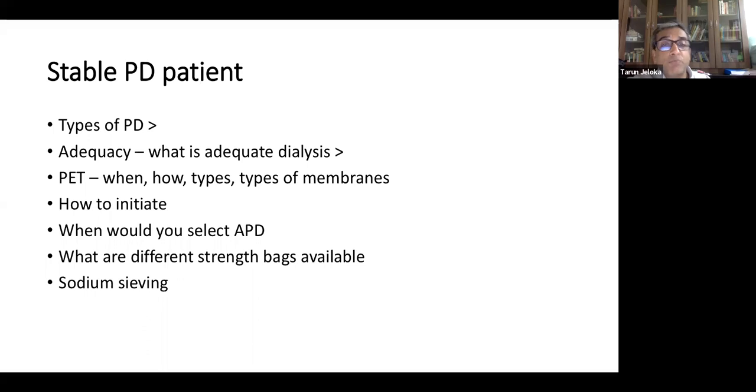But many times we do not initiate PD patients on a 24-hour cycle, to give some comfort and relaxation, and also for the concept of incremental dialysis, which you should know. When somebody is on CAPD, continuous ambulatory peritoneal dialysis, we give them a night dry. They do an exchange, 3 or 4, whatever you decide, during daytime only; nighttime is dry. So the belly is dry at night, and practically they get dialysis for 12 to 14 hours only, right?